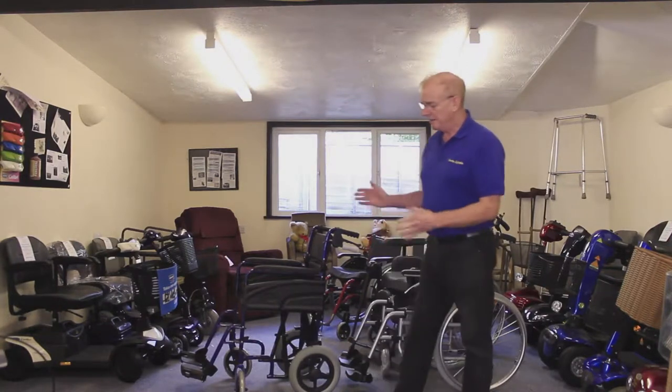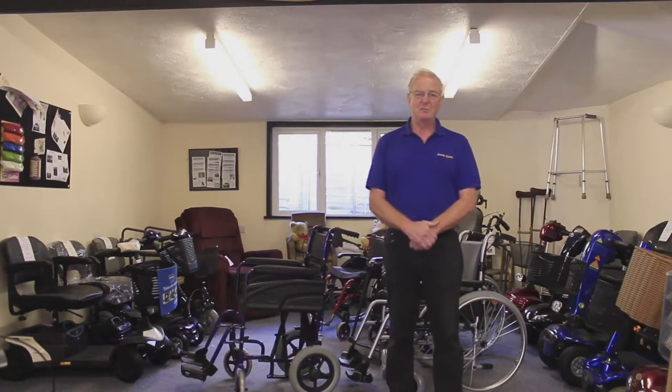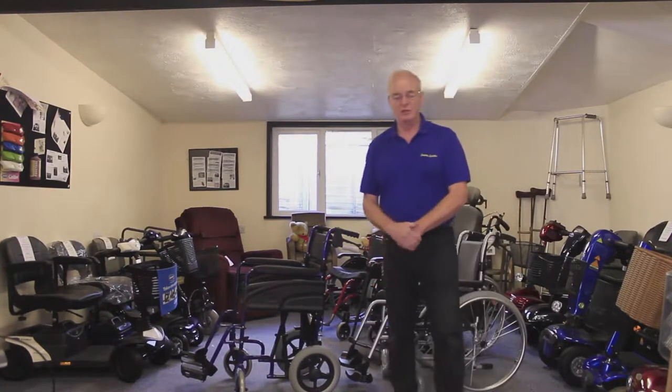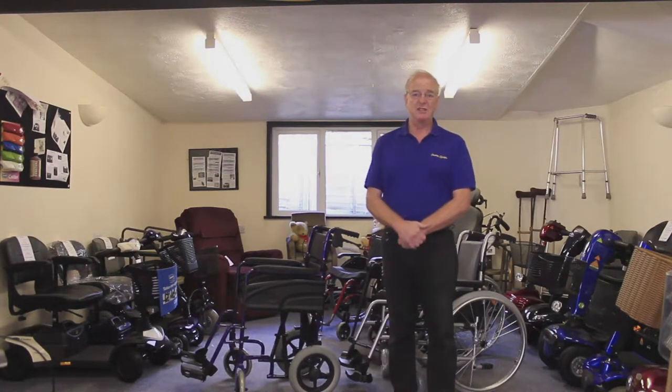Point two: even though it's only a basic manual wheelchair, we still recommend that you look at some form of third-party insurance. It should cost you about £30 a year, but if you do catch someone's heels as you're driving along, the amount of money you could incur in costs could be phenomenal — so it's well worth having, never mind protecting the chair.